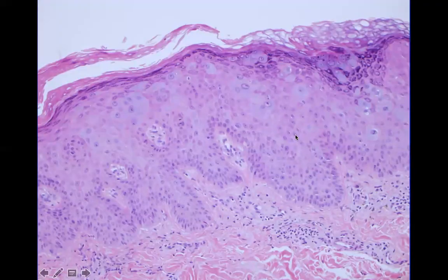Okay. This is epidermodysplasia verruciformis. So we know that these have different HPV types, and this is what the virus looks like in the epithelium. Instead of that coilocyte we saw with the verruca vulgaris, we now see this kind of blue-gray cytoplasm in our cells with the active inflammation.